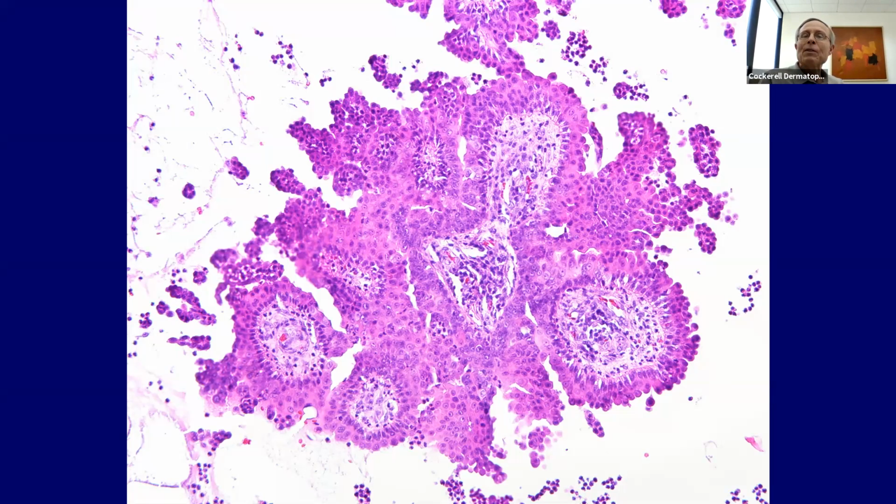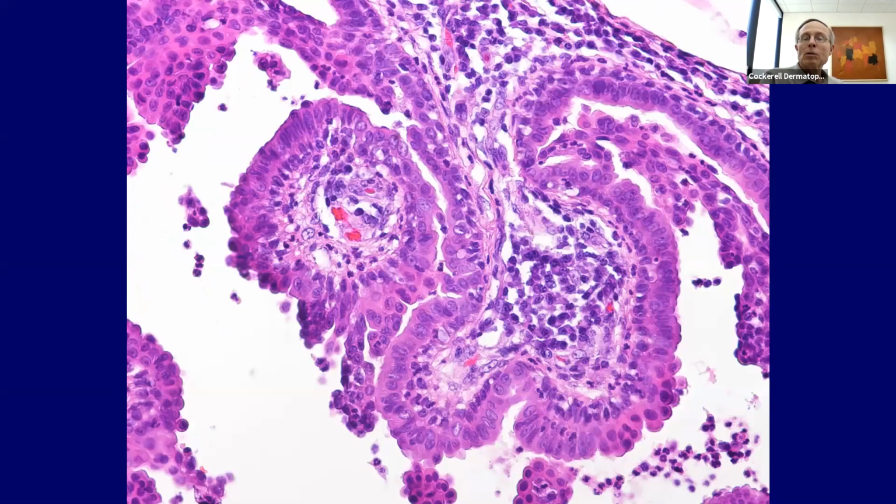So one caveat: never use just one criterion to make a diagnosis. Here you see the plasma cells. So put everything together. Now, if you see pathognomonic molluscum bodies or something like that, maybe you can use one criterion, but generally we put together all of the pieces to make the symphony. We don't just use only the wind section or the percussion section.